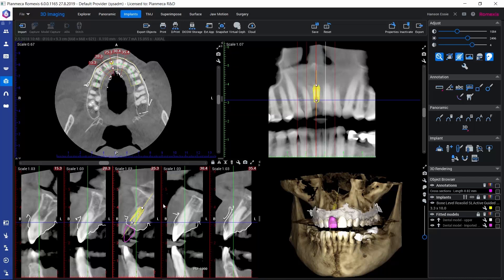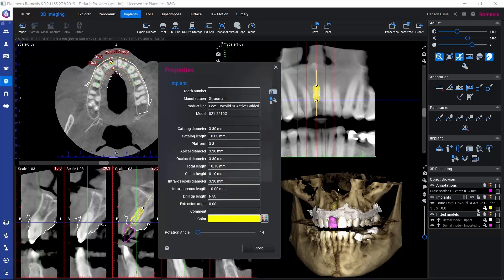If there would be the need to rotate the implant around the vertical axis of the implant, we could open the implant properties — for example, through the object browser — and we would find this rotation angle. We could use this slider in order to make the implant rotate around this vertical axis, for example if it would be a non-symmetrical implant.